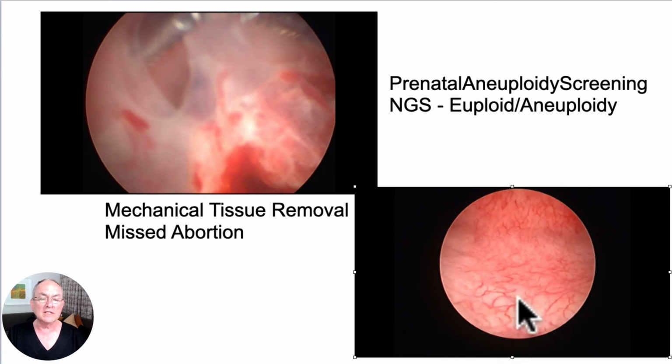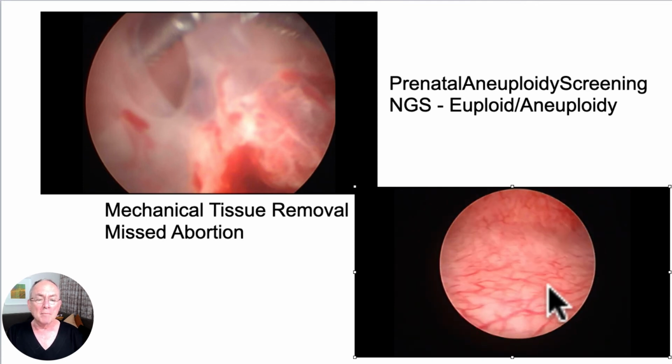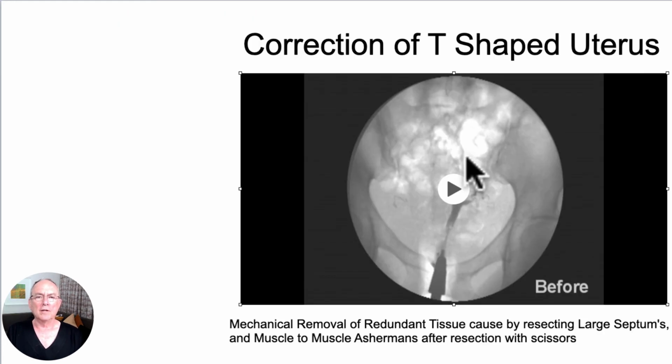And you can see this decidualized endometrium here. And this is the tissue that we keep scraping out, and that's why D&C takes us that long, because the sac is out, and now we spend at least another 15-20 minutes evacuating this tissue. And I think that is one of the reasons why we get Asherman's when we do D&Cs with a pregnant uterus.